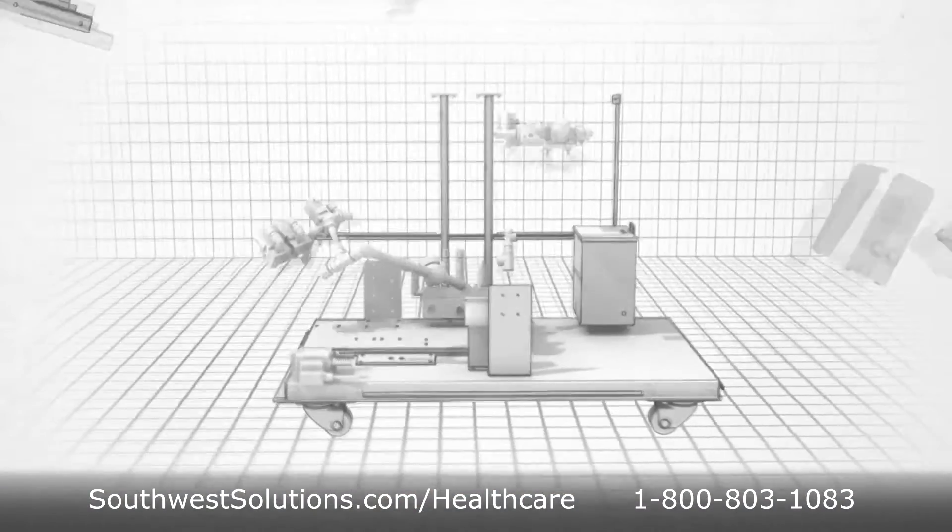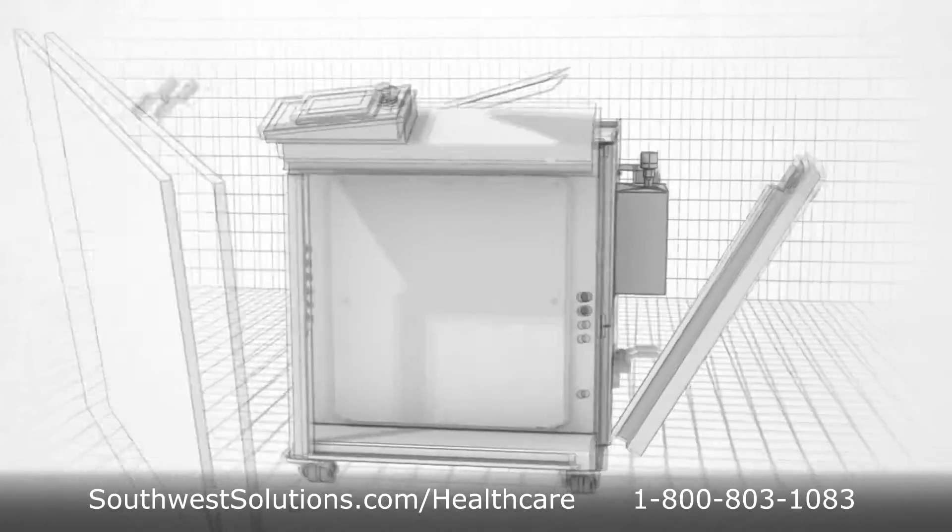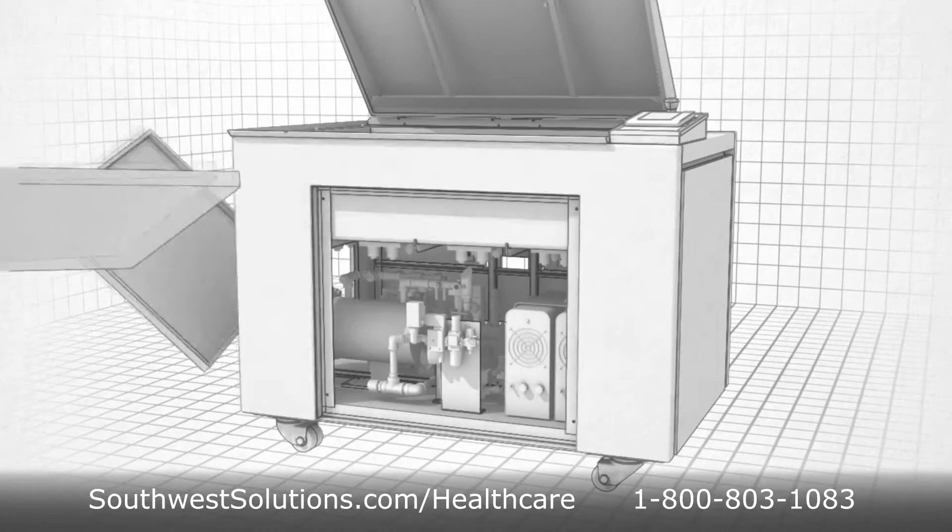Now there is an alternative cleaning process. Through an automated multi-process washing approach, surgical instruments are cleaned completely, both inside and out.